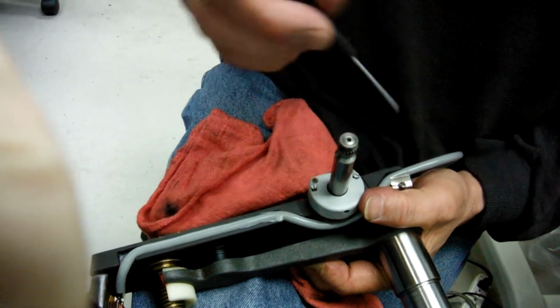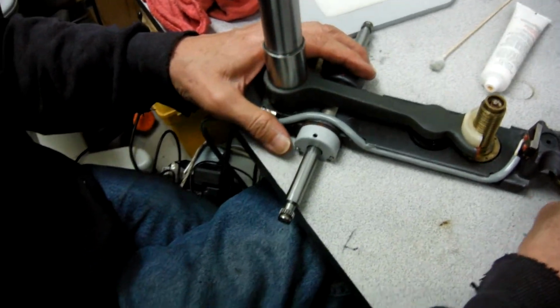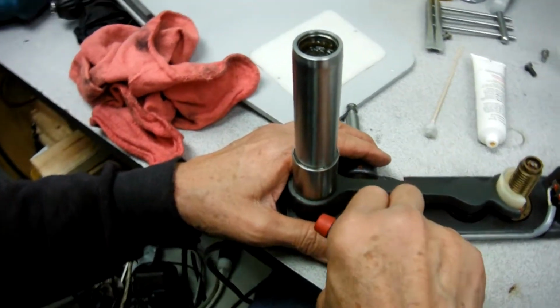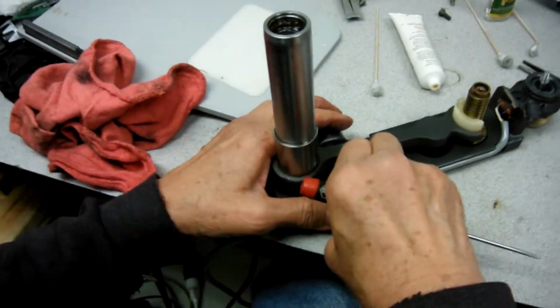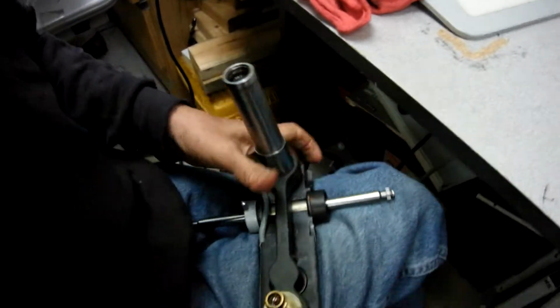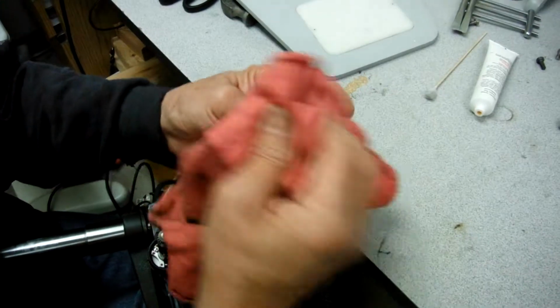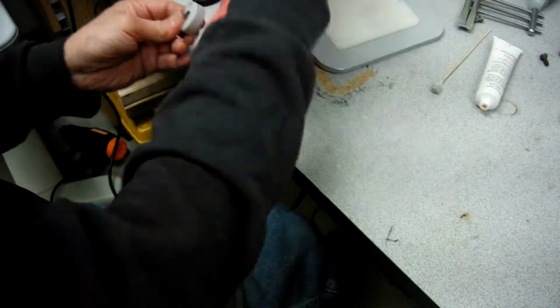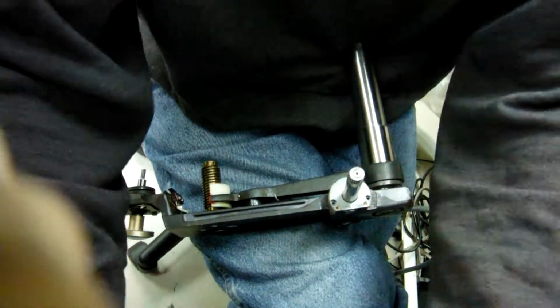I used the wrong screwdriver, so it's hard for me to put the screw back in there. Okay, after you put the cover back, you can also put the lock knob back and hold the shaft in place. That's good. Then you can do the other side the same way. You clean the cover, and then just put it back in place with the two screws.